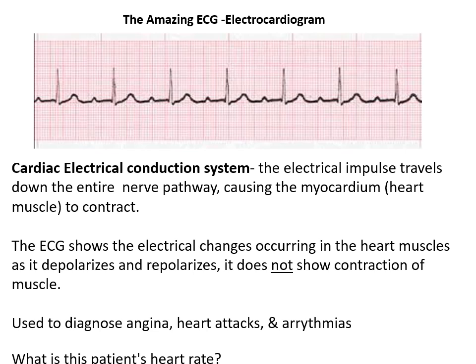So you can imagine that we get ECGs and rhythm strips, such as this one, to look for arrhythmias. And arrhythmias are just abnormal rhythms. Another term for it is dysrhythmias, same term. We can diagnose heart attacks within the electrical activity that we see on an ECG. And we can diagnose many other conditions, and some that we'll get to as this module goes along.